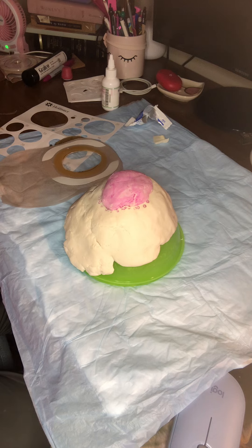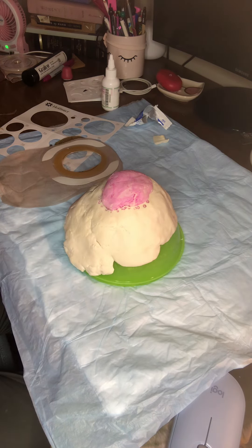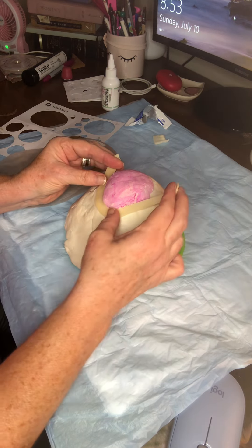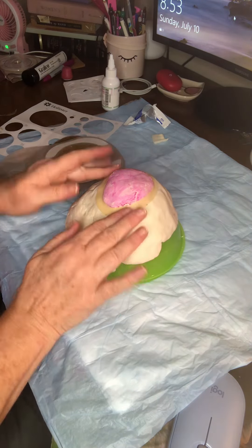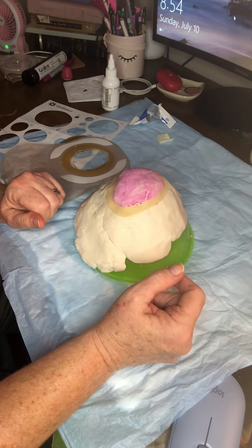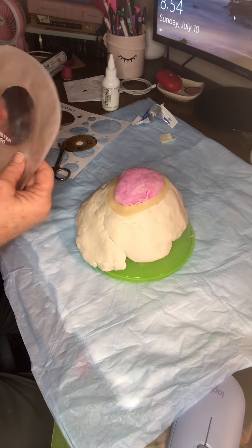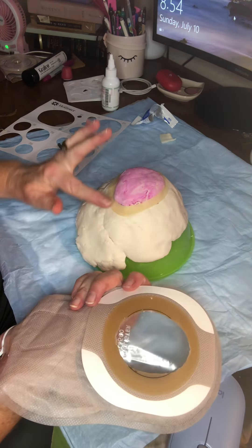At this point, I think the easiest way to pouch is to put a barrier ring on, which is important to keep this area dried out. Tear your barrier ring like this, stretch it, and it'll go right around there. If it doesn't quite reach, that's okay — make sure you're getting it over that irritated skin. If it touches the stoma, that's fine. Let the stoma be exposed, with the barrier ring going right close to the stoma. This has been cut to just fit a little bit larger than the stoma.